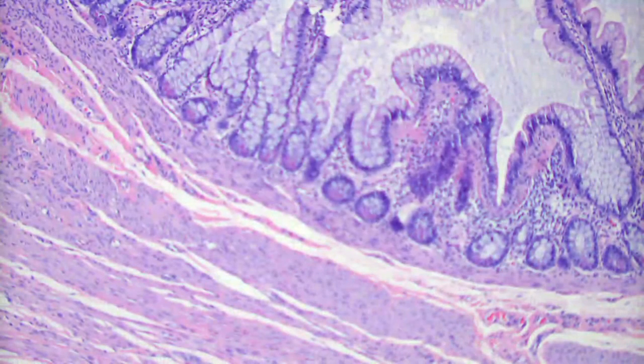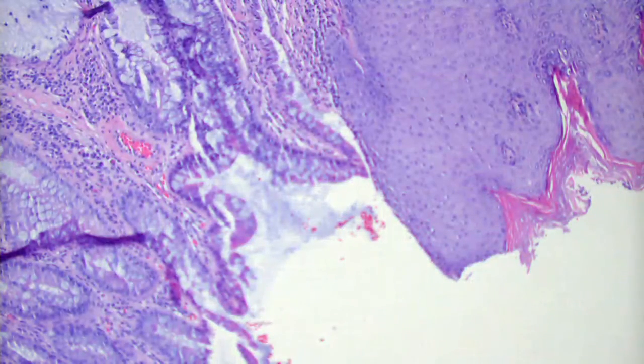So this doesn't really have any inflammatory infiltrate except at the surface, where maybe it's kind of got an irritant reaction. I'm not sure what this is. Well, you actually knew what it was. You called it an umbilical polyp, a congenital umbilical polyp. Which, what is a congenital umbilical polyp? Is it the omphalomesenteric duct, or whatever they call it.